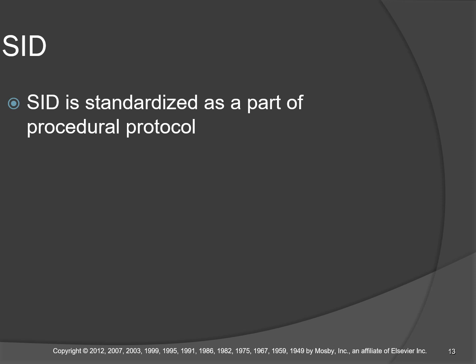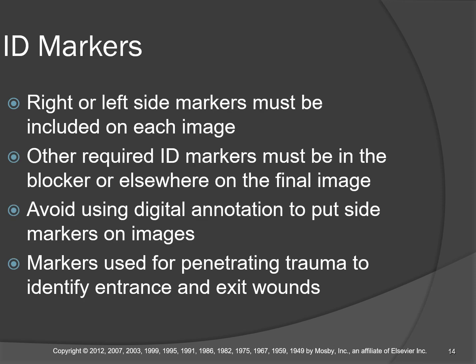Yeah, we have a natural cadaver skull that I can take over, and I can show you. I don't think we have an odontoid, but we do have a natural cadaver. Might be able to show you some magnification effects and show you how it changes some of the things. So, when in doubt, just use a standard SID.